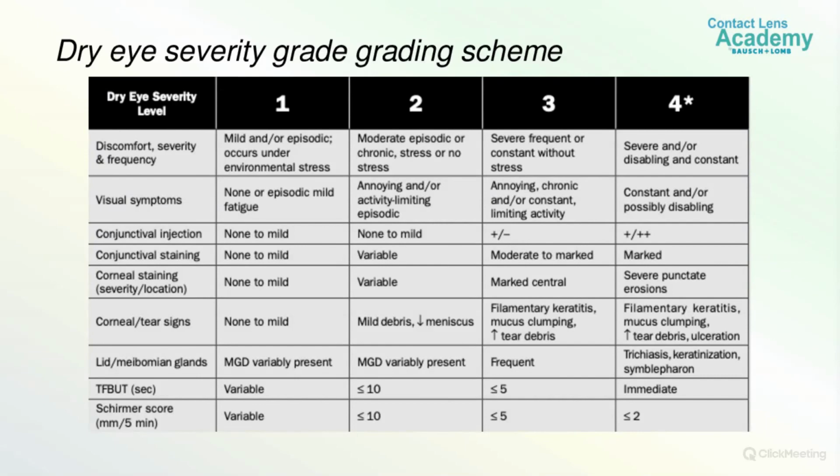To summarize all the clinical diagnostic tools, I would like to show you this table once more. You can use this to detect dry eye disease. The first two columns say that the patient may have dryness of the eye from contact lenses, or just dryness of the eye, but only signs. But the third and fourth columns are a case of dry eye, and the patient should be referred to the ophthalmologist.